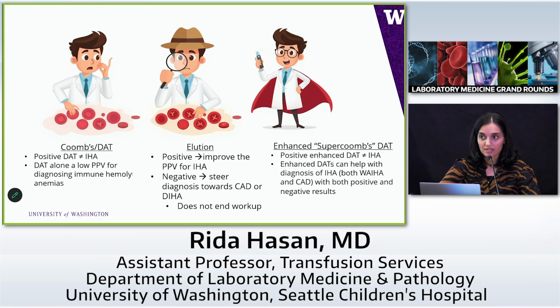And then the third scenario with the Supercoombs, a positive enhanced DAT also does not mean immune hemolytic anemia. As I showed, some of the patients with a positive DAT didn't actually get diagnosed with immune hemolytic anemia. Enhanced DATs can help with the diagnosis for sure. And even if it's positive or negative, it can help make the diagnosis a little bit clearer and change the management for these patients.